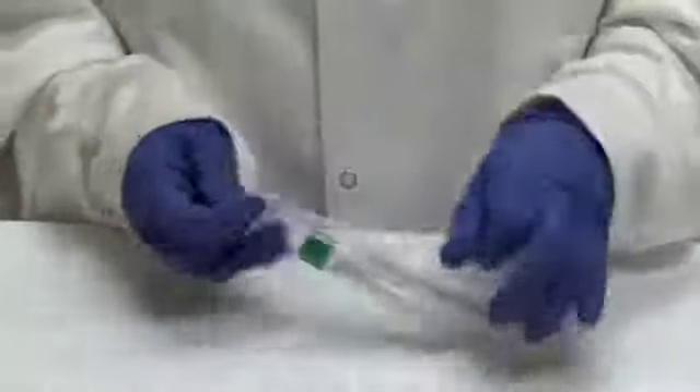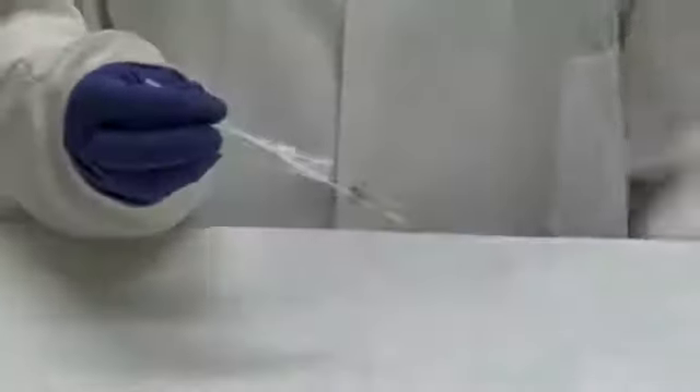Always remember to perform hand hygiene before and after the procedure. In addition to standard personal protective equipment, you will need a glass slide since a microscopic preparation is to be made for staining in the laboratory. The swab may also be sent to the laboratory for their preparation of the slide. Explain to the patient what you are about to do.